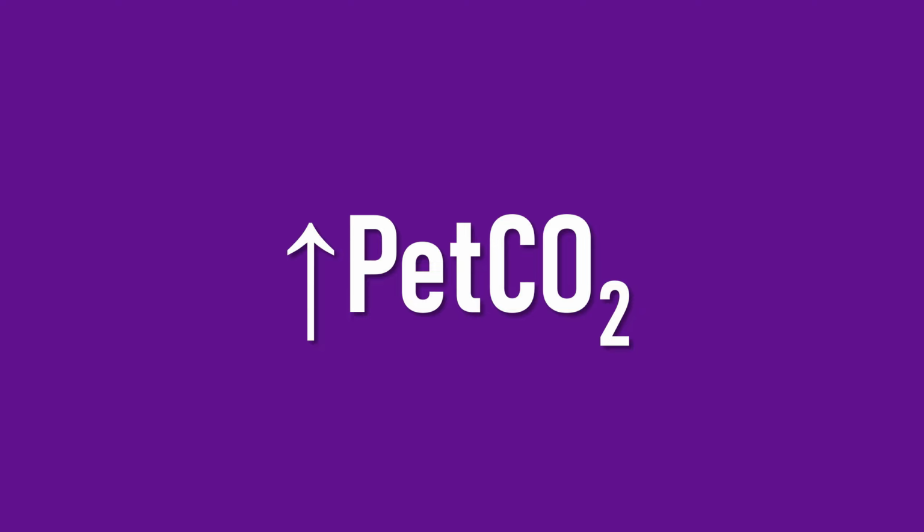Once you have intubated a patient and confirmed that the tube is in the correct position and generated a capnometer number, you need to continue to follow this number throughout to maintain the end-tidal CO2 at the level that you think is appropriate for the patient. For most people, that's an end-tidal CO2 of about 35 millimeters of mercury, or just around 4.9 to 5 kilopascals. Of course, if the patient normally has a high partial pressure of CO2 in their blood, someone, for example, with COPD, you will target a higher level.